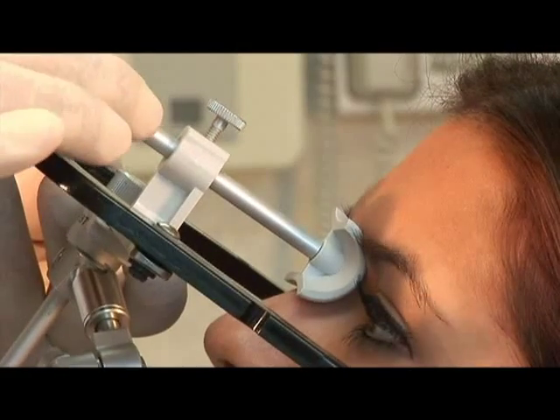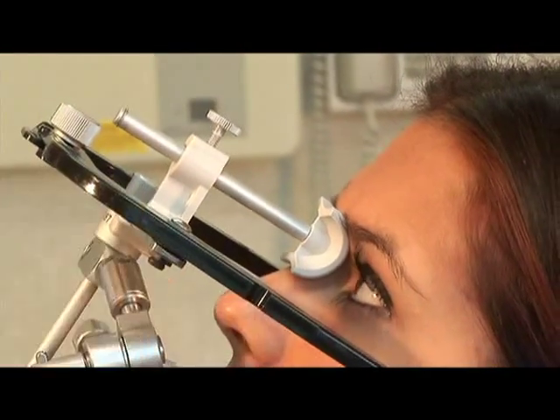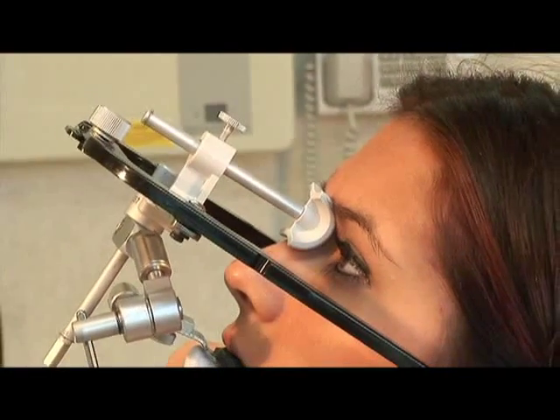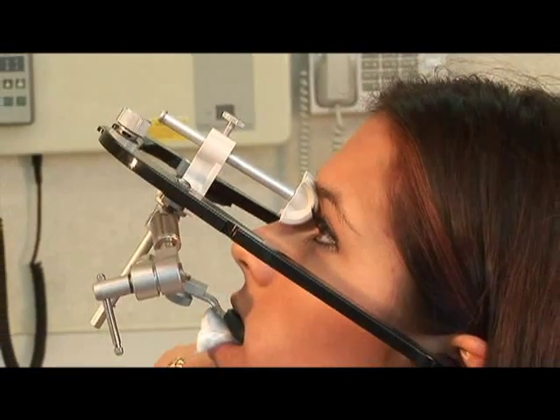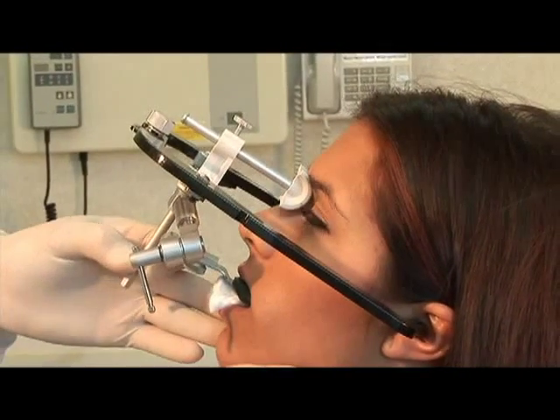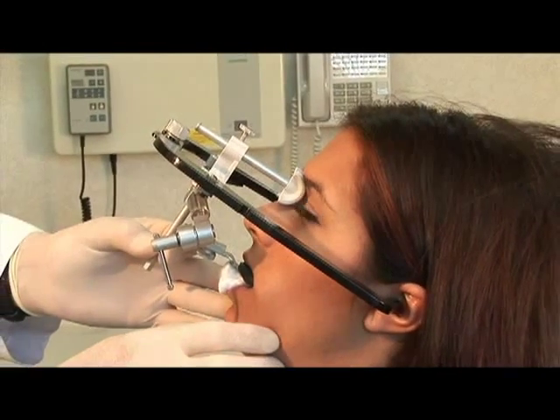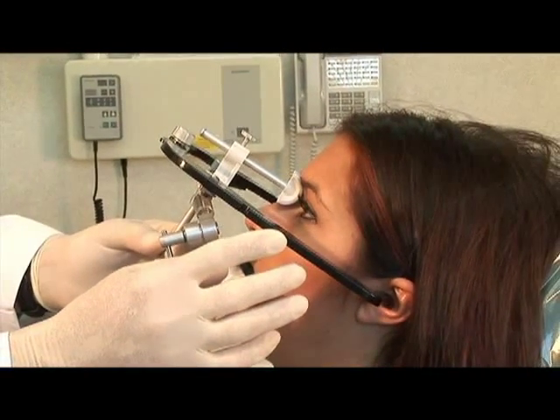Tighten this. Now you can take your hands away, turn your head just gently towards me right there. That's fine. You can put your hands down now. With your eyes, I want you to look straight at the tip of my nose and just stare right there at that point.